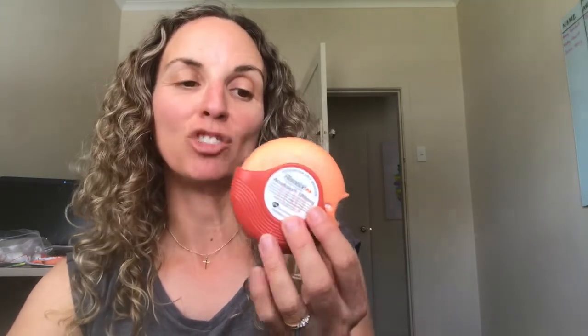Accuhalers are a pretty cool alternative to the puffer that you have to use with a spacer, because you don't have to use a spacer with one of these. It's a dry powder device with a really cool little mechanism inside, so I opened one up to show you what's going on inside.